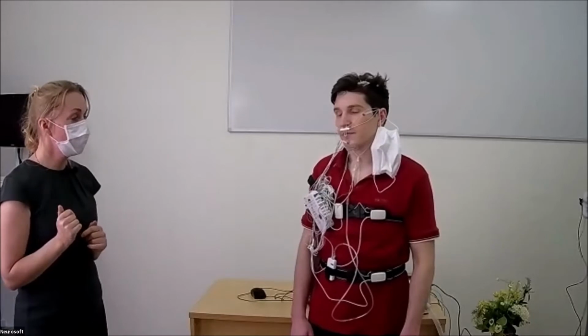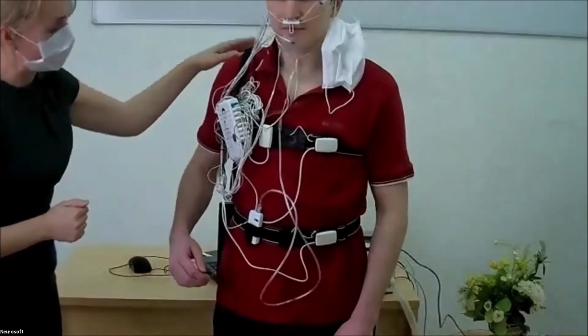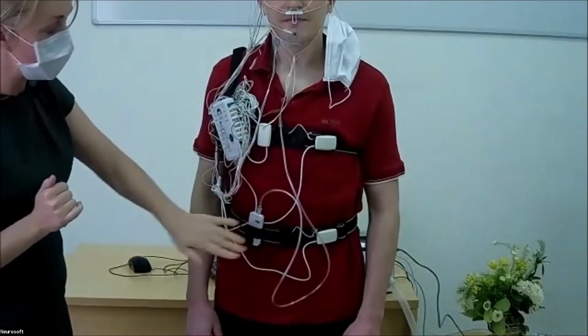But we can register the snoring with help of the cannula too. So next, during the respiratory monitoring, we measure the chest and abdominal effort, the breathing effort. And to do it, we put on the patient the two belts, thorax belt and abdominal belt.